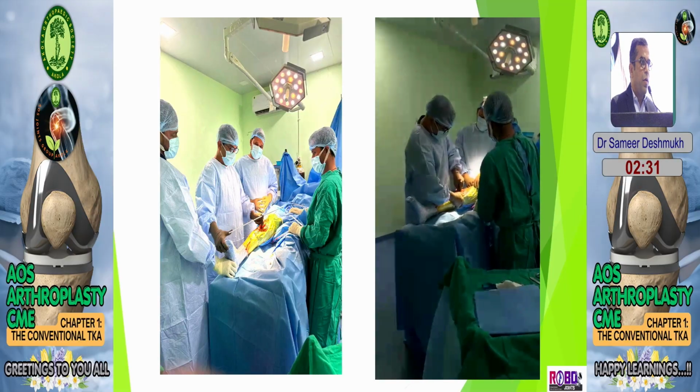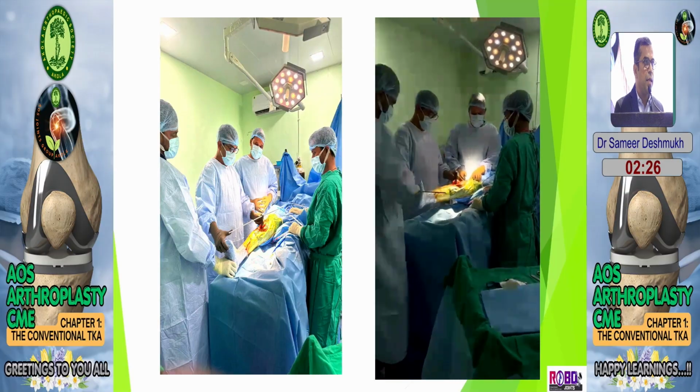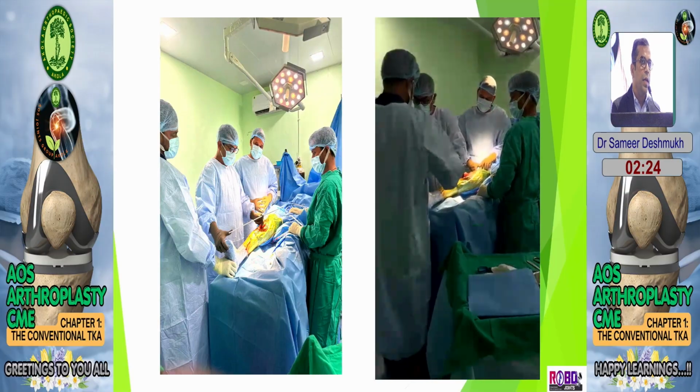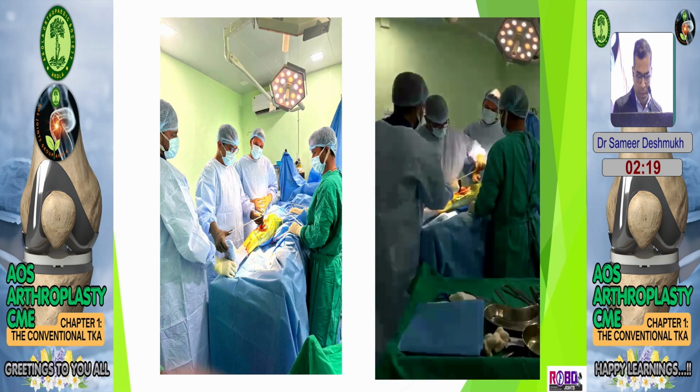This is the alignment rod. I put an alignment rod and recheck what I have planned over the x-rays. Yes, whether I have achieved that the center of the head, center of the knee, and the center of the ankle are in one line.